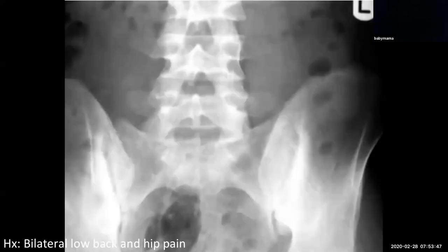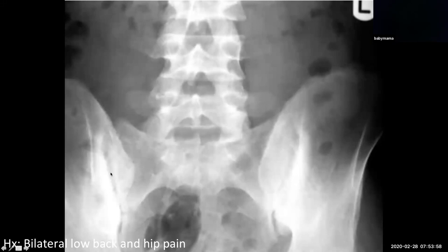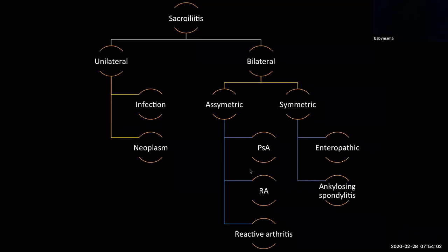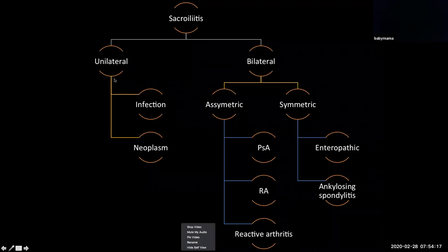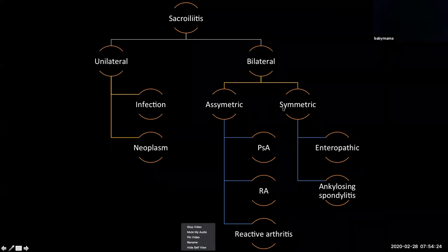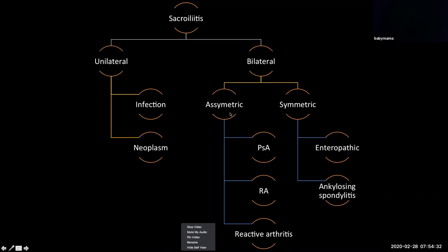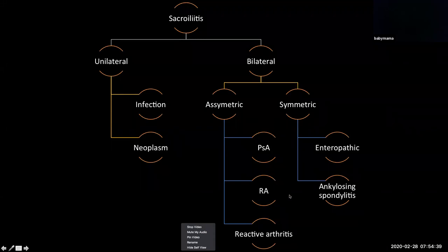How about this case? Subtle bilateral low back and hip pain. We see subtle sclerosis and erosive changes of both sacroiliac joints — a case of sacroiliitis. The workup for sacroiliitis can be divided into unilateral or bilateral forms. Anytime you have unilateral or monoarticular arthropathy, the top things to exclude are infection, infection, infection. But in our case it's bilateral. Once you're on the bilateral limb of the algorithm, you want to look at whether the SI joints are involved symmetrically or asymmetrically, as that leads to different differential diagnoses.